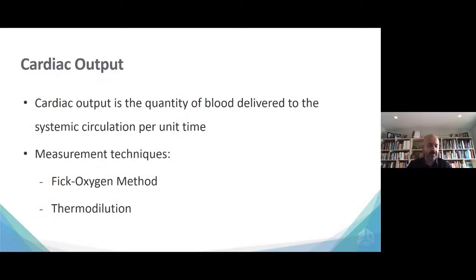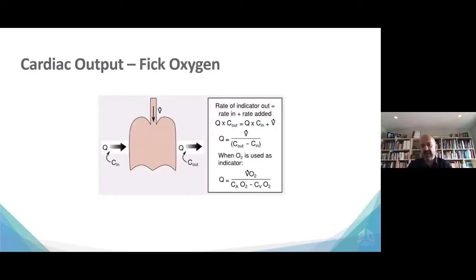The Swan-Ganz catheter, or PA catheter, gives you another modality which is very important. You can get this with other things, like echo or MRI, but it's almost impossible to get this at the bedside otherwise. Cardiac output can be determined by the PA catheter by 2 methods. One is the Fick method, and the other is the thermodilution method.